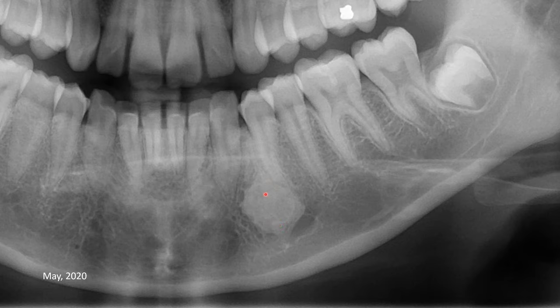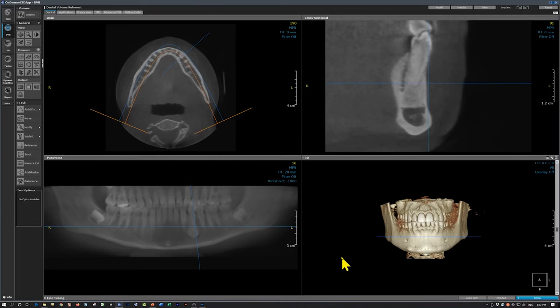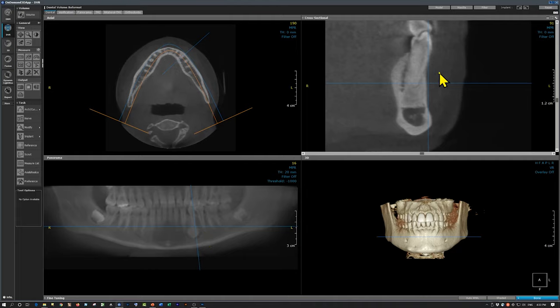Let's review this on a CBCT scan, which will give us a better understanding of the process. Specifically, we want to see if this mass is affecting the cortical plates — whether it is expanding or eroding them. This blue line indicates the slice. On this slice we can see the labial cortical plate and the lingual cortical plate. The radiopacity is probably arising from the buccal cortical plate and reaching the lingual cortical plate.